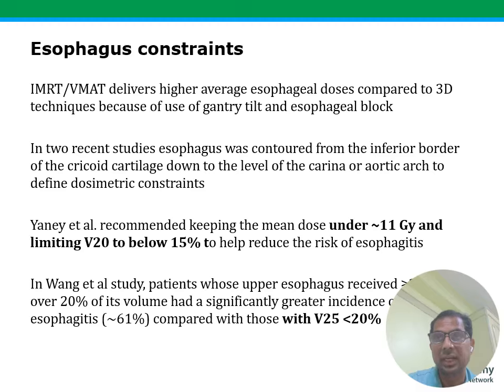But we need to understand that our threshold for accepting grade 2 or 3 esophagitis for breast is much lower than say for lung cancer, where we expect that to be the case. So if we are not careful, we end up giving more esophageal dose.